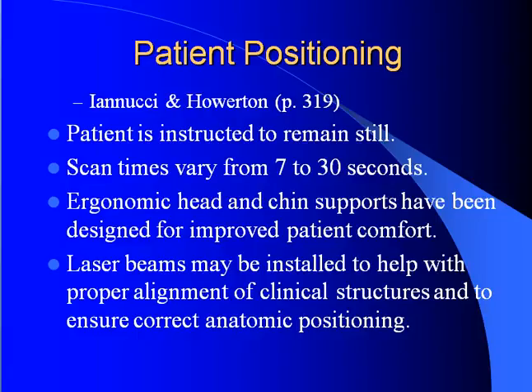The patient is instructed to remain still. Scan times vary from 7 to 30 seconds. Ergonomic head and chin supports have been designed for improved patient comfort. Laser beams may be installed to help with proper alignment of clinical structures and to ensure correct anatomic positioning.